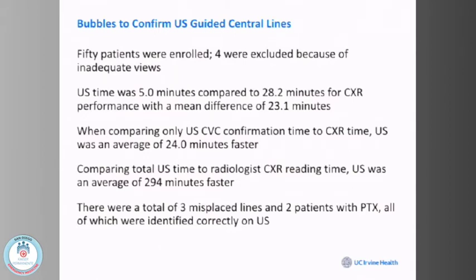We put central lines in. I'm just sort of bringing this up. One of my trauma surgeons is a part-time trauma surgeon at UCI, but he's mainly up at Holy Cross Hospital in Los Angeles, in Chatsworth. This guy Boris, he's so funny. He goes, probably 3 years now, I haven't ordered a chest x-ray, and he spends his life in the SICU. He's like, I do everything now by ultrasound up there at Holy Cross. Nobody seems to care, and it's fine, and I haven't had any problems. It's just because ultrasound is more accurate than a chest x-ray, certainly for pneumothorax and for line placement.